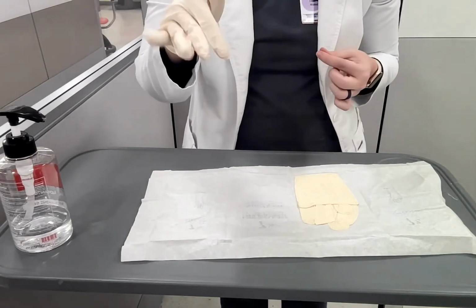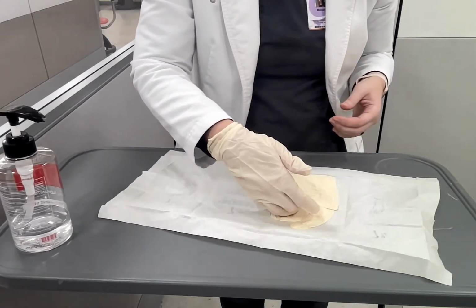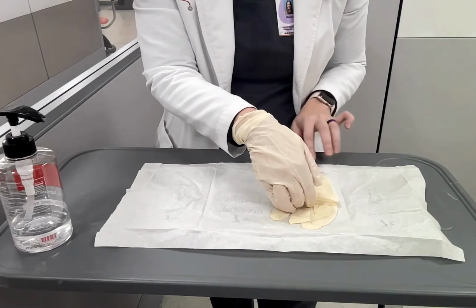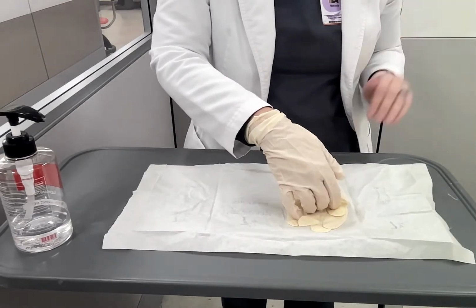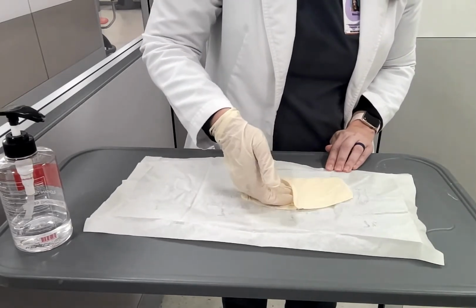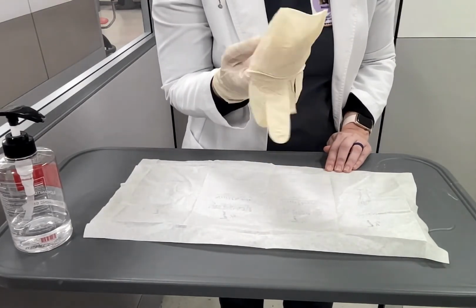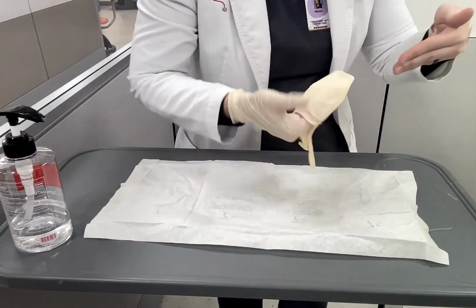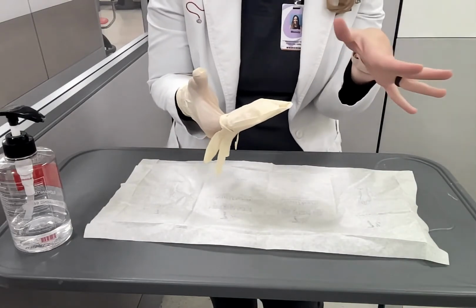Next thing is I'm going to stick this hand, scoop it, sterile, sterile, sterile. I'm going to touch the sterile part of this glove. Now notice I could just go like this and wiggle my fingers underneath, but you can touch the outer 1 inch. So I would, so that you don't go like this all over the place. Anchor your set here. Pick up, I'm going to show you sideways. Pick it up like that. You can use your thumb to scooch that one on there. But as soon as your hand comes in close, I want your thumb to flag out. You do not want to be even close to touching your sterile thumb to your hand that's not sterile, okay?